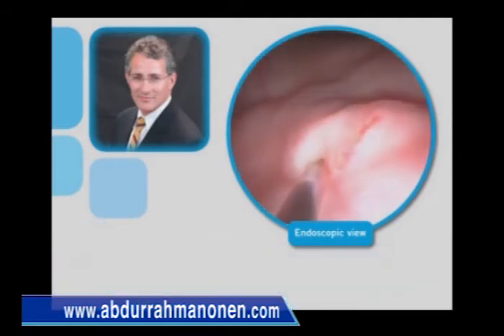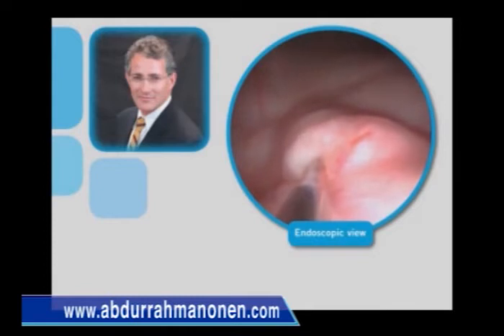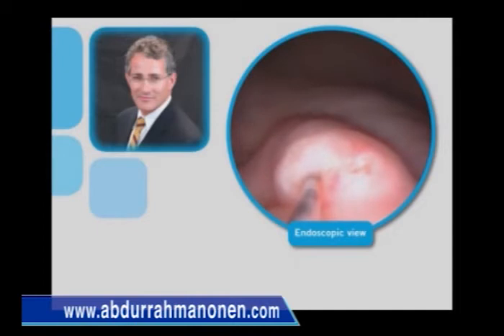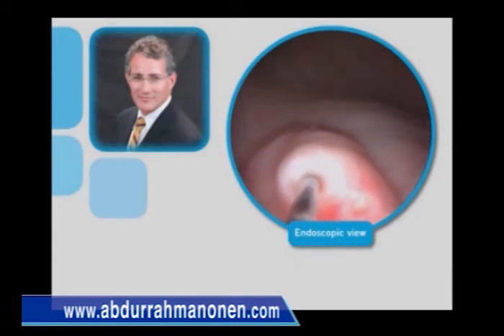Once the needle is in position, hydrodistension is stopped, and a very slow injection is performed without placing strain on the ureteral orifice. As the injection proceeds, the ureteral tunnel will be noted to rise first distal to the site of injection, and then proximally with further injection.